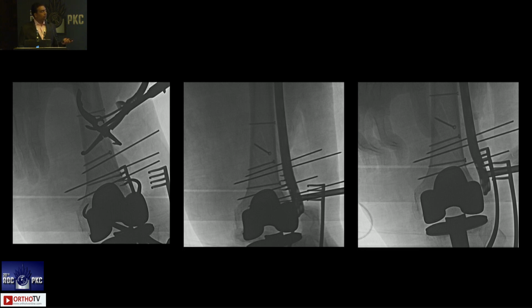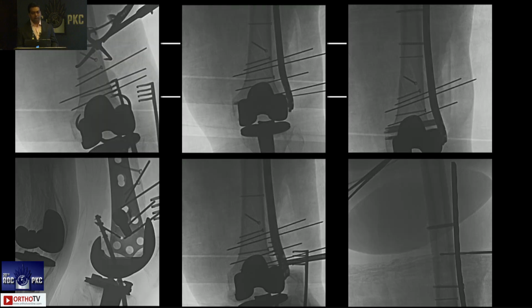Again, we need to keep in mind that a lateral plate is one plate for all. Therefore, one plate does not fit every patient. As the patient's anatomy is different, you need to calculate. We cannot keep this plate flush to the bone, as it may displace the fracture. Therefore, it should be applied in an internal fixator way.